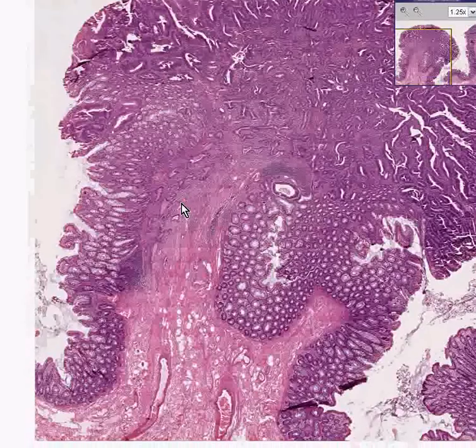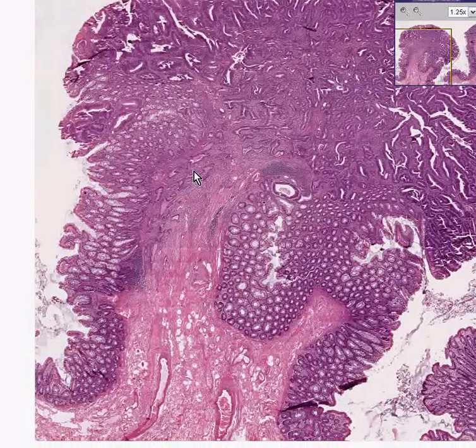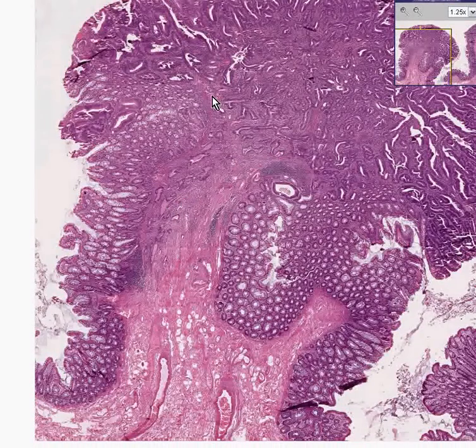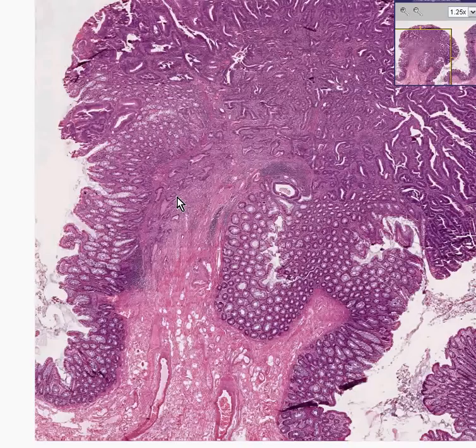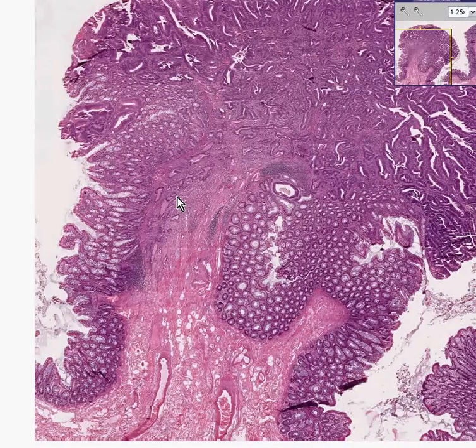Once any tumor infiltrates into the stalk and beyond the muscularis mucosa, it then runs the risk of being a potentially metastasizable tumor.